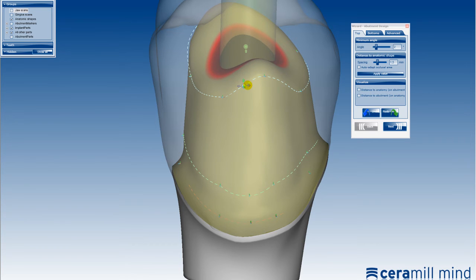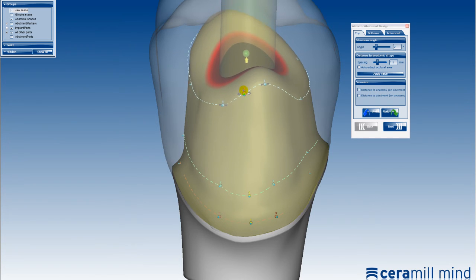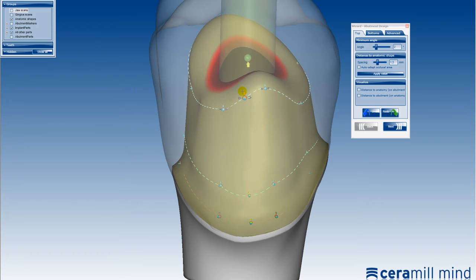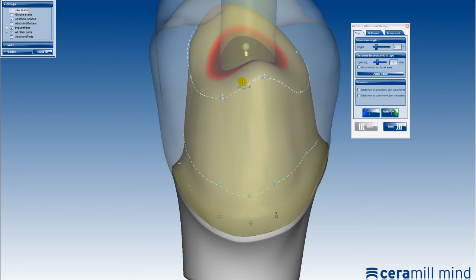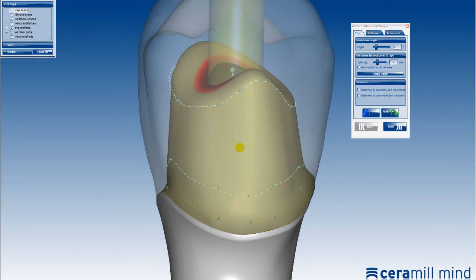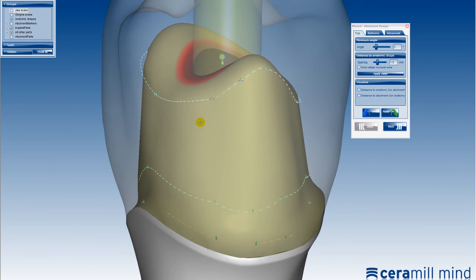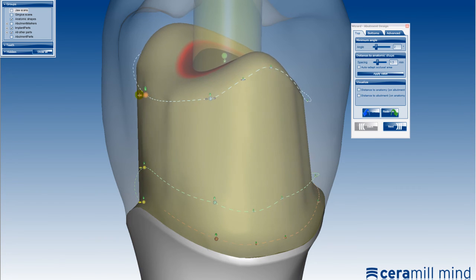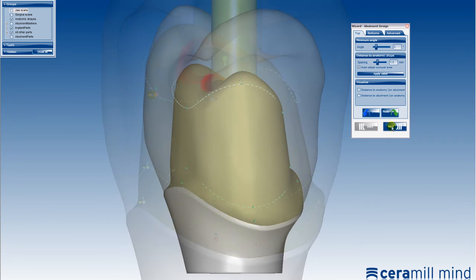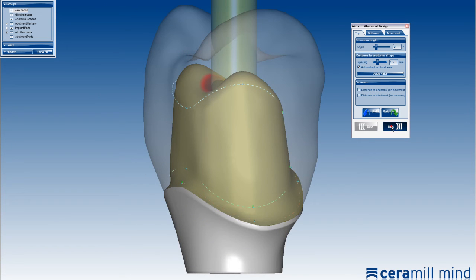All points in a line can be moved simultaneously by clicking on a control point and sliding it while the control key is pressed. The abutment can be customised with the usual free-form tools using the Next button.